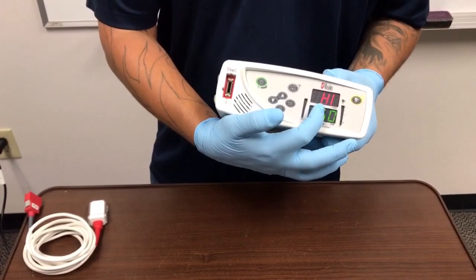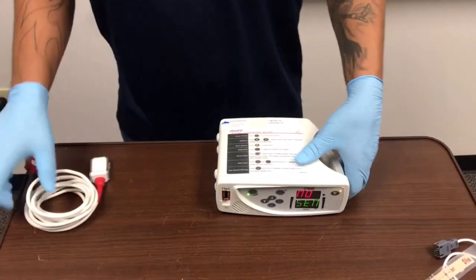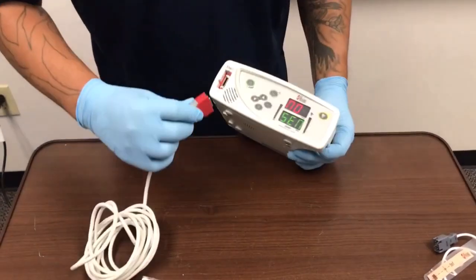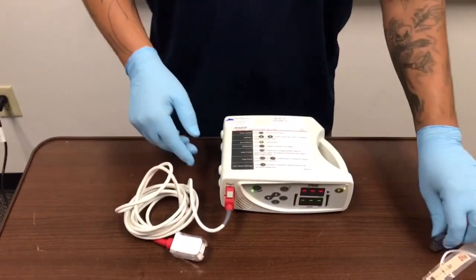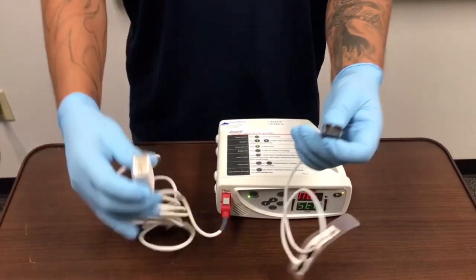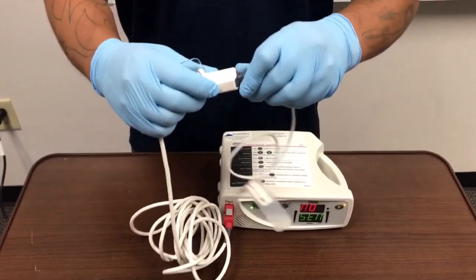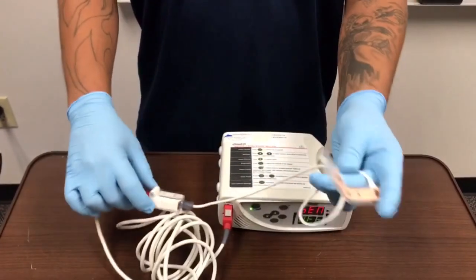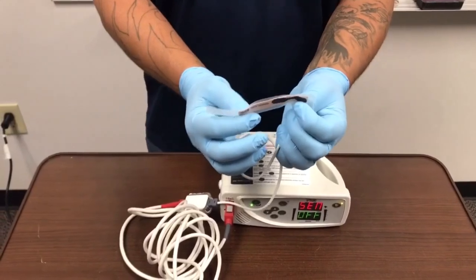Your settings will pop up. Once you see 'no sensor,' you can go ahead and plug your patient cable into the RAD8. Take your sensor and plug it into the patient cable also. Now you can start using your sensor on your patient.